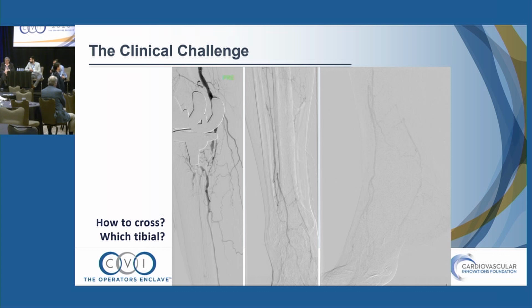You're going to have a hard time. I would definitely put a catheter in antegrade, but you're going to have a really hard time antegrade because of that collateral that's coming off right at that distal cap, because that distal cap is the proximal cap. That's a hostile proximal cap. It's got an angle to it there. It gives off the collateral. So I think retrograde peroneal access would be helpful here.